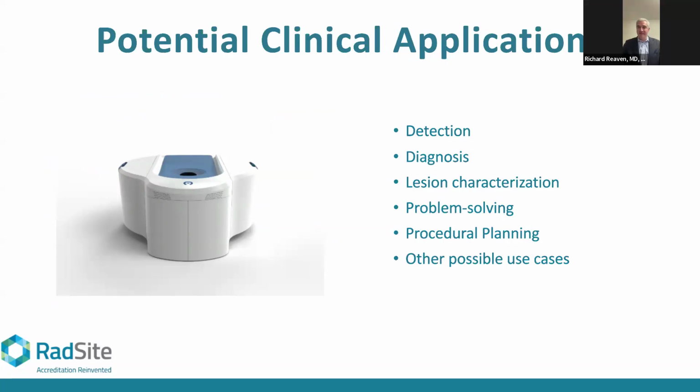Up until this time, I've basically read over 1,000 breast CT examinations in the past few years. So I have a lot of experience when it comes to using this technology in a current workflow environment and identifying abnormalities, characterizing lesions, and making diagnoses of breast cancer. And so what I found, and those of us that read these studies, we talk about the literature, we talk about the characteristics, we talk about all these findings.